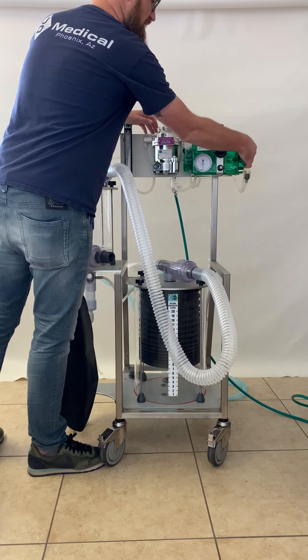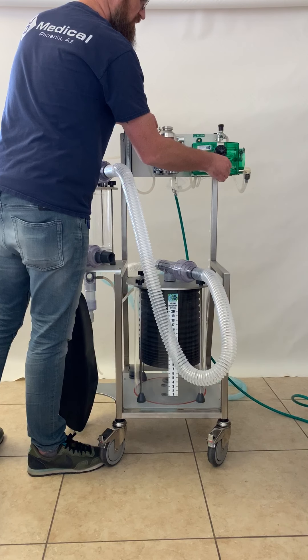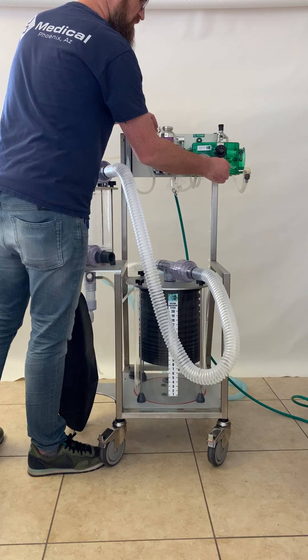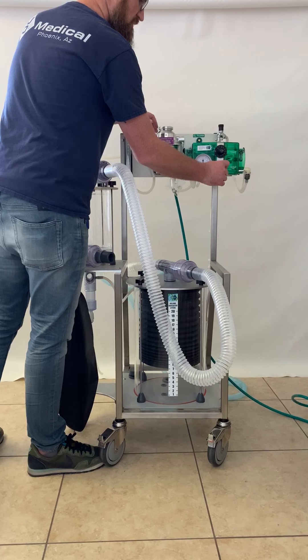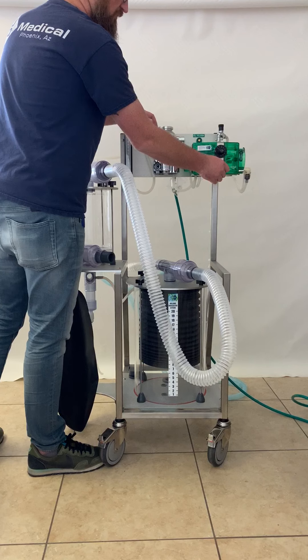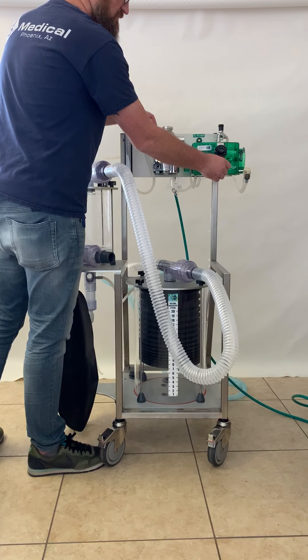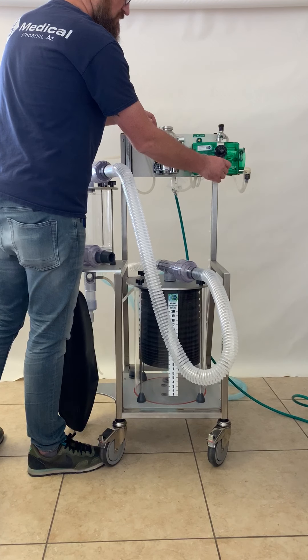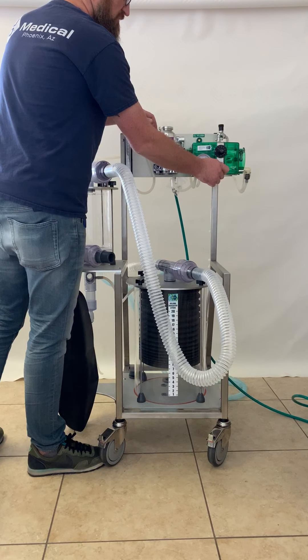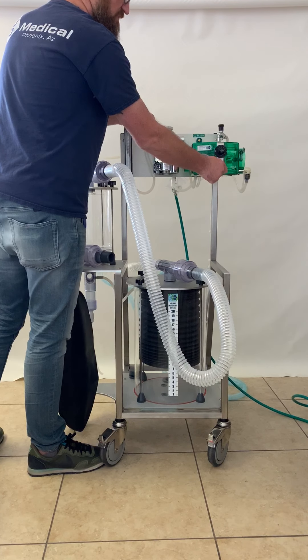Now to demonstrate the expiratory timer, we'll open that. As you open it further, it will go faster, and slower as you turn it clockwise until it's off.